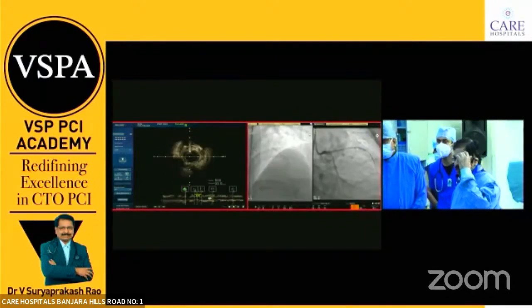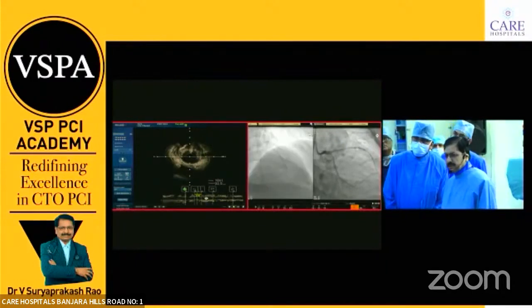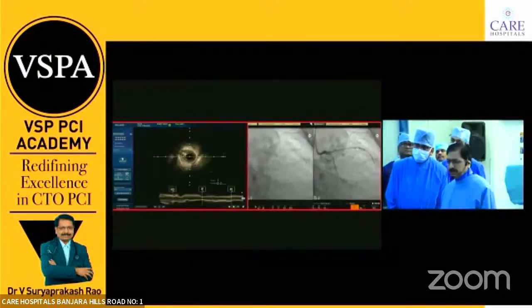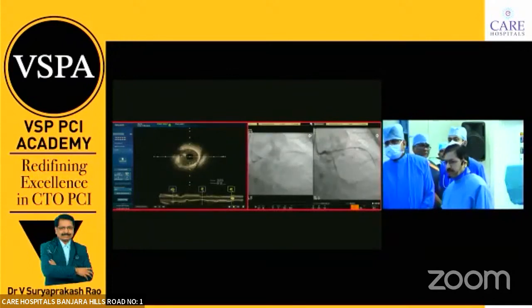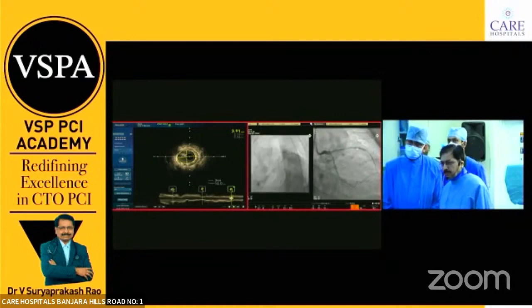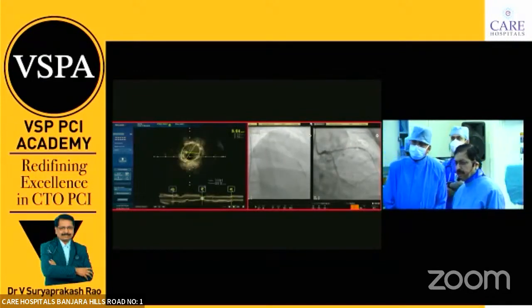So we try to put a spot stent in the mid portion of the dissection, and a 2.5 by 22 Synergy has been deployed at 11 atmospheres. Then the proximal one we try to cover, but there's a small flap before the distal stent. That's why we covered from the ostium with overlap stenting of a 3 by 38 Synergy stent that covered the ostial LAD to this portion. So usually you see remodeling in these vessels. We have given some intracoronary nitroglycerin, dilated the 3 stent, and then we gave high pressure dilatations.